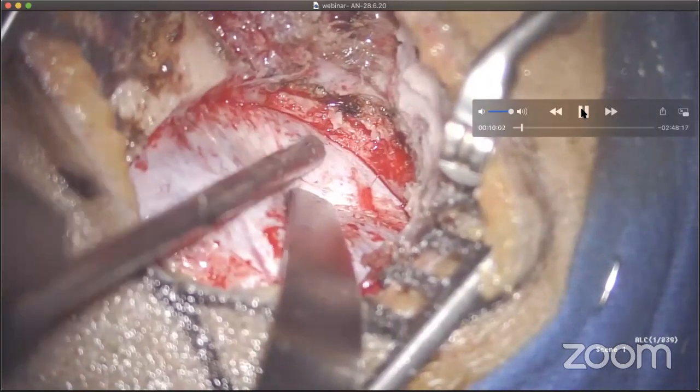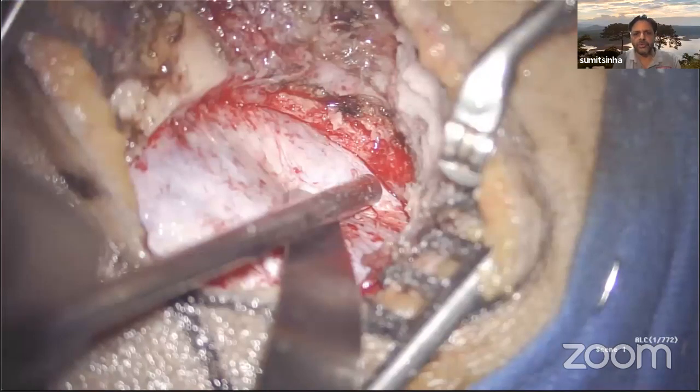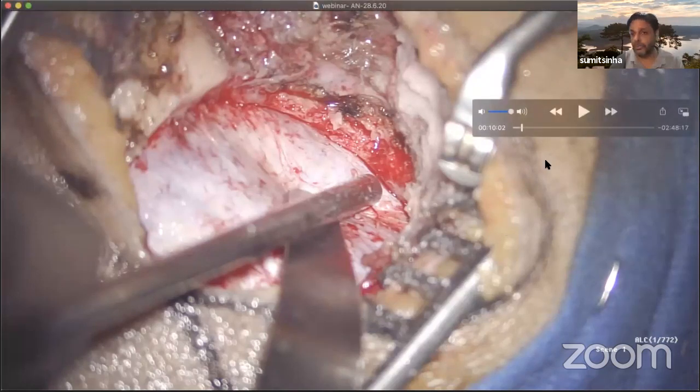Sorry, sir, I have a question. Don't you have problems with the soft tissue retractors in those kinds of small incisions? As you can see, this is a wonderful exposure, as much as I can get in a traditional exposure. These are two instruments, normal laminectomy retractors that I use, one down and one up. I can fairly manage, and no soft tissue comes into my view.